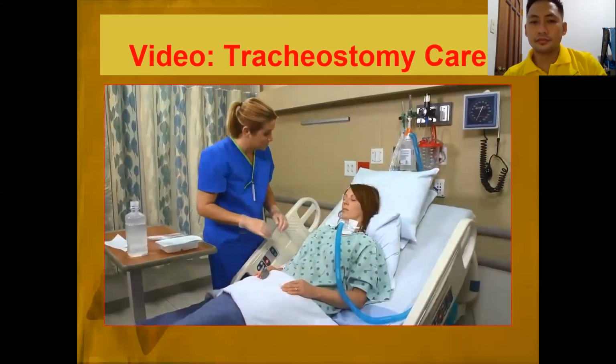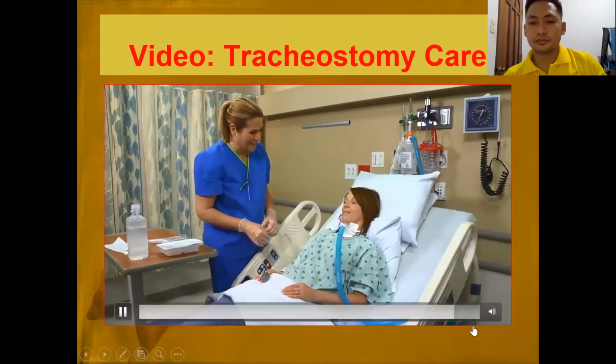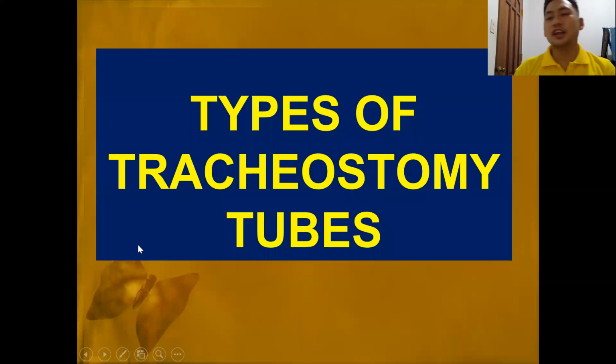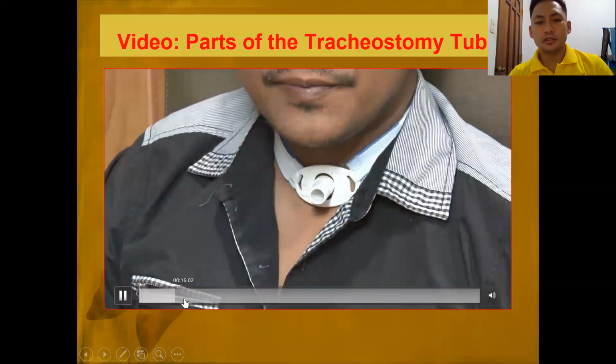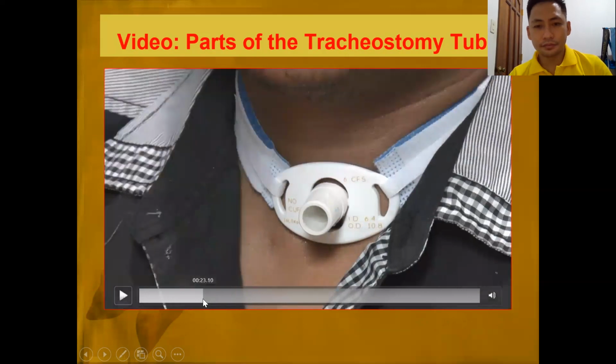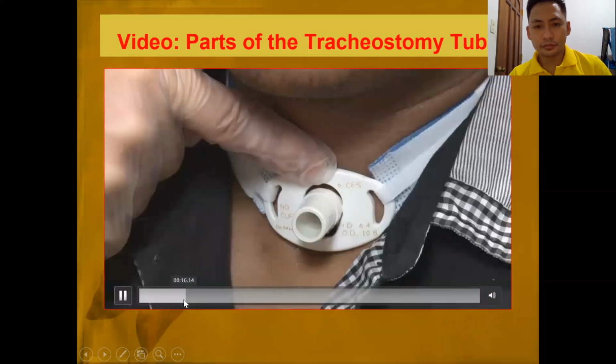Are you comfortable? When you've finished providing tracheostomy care, so that is how you provide tracheostomy care. So papracticean din natin yan in our skills laboratory. Okay? So we have the different parts of tracheostomy tube. We already identified it. It should be flat against your trach tube in place. It should be flat here.